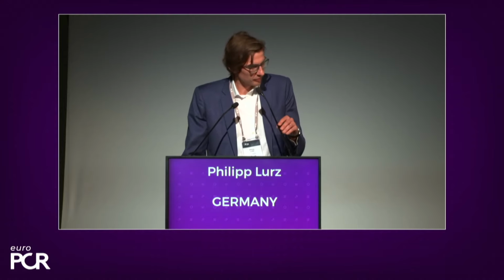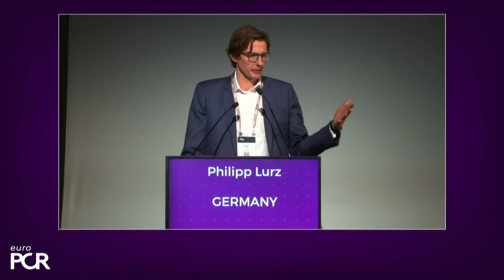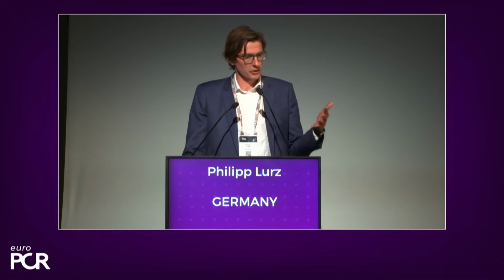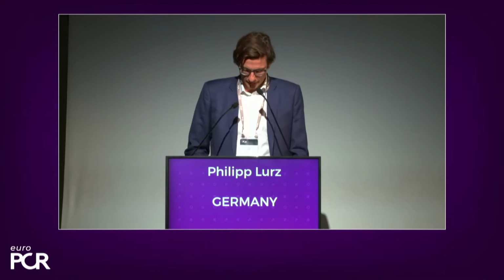And probably all this imaging that has been difficult to define for the echo guy has to be inside the device. So you have to not restructure the mitral, avoid all this tissue. Maybe you need one or two devices, we don't know, but at least you have somewhere to go. Yes, we thought so. We weren't entirely sure whether it's an additional leaflet or whether it's P3 or A3, but obviously it's a commissural pathology, it is a massive MR, and as you said, there is some tissue which can be bridged, and that was the treatment goal.